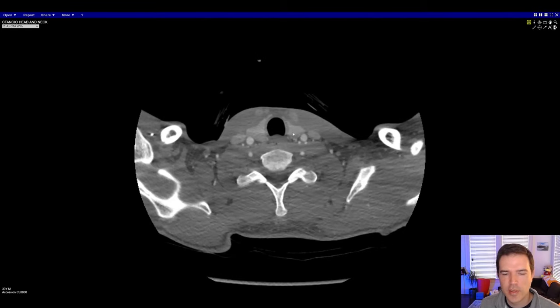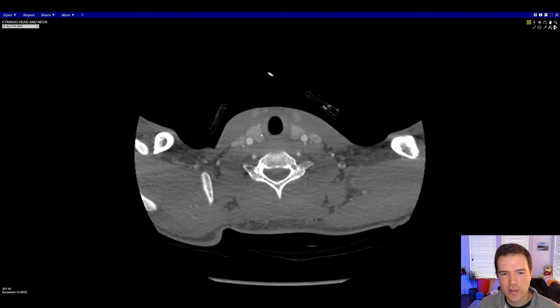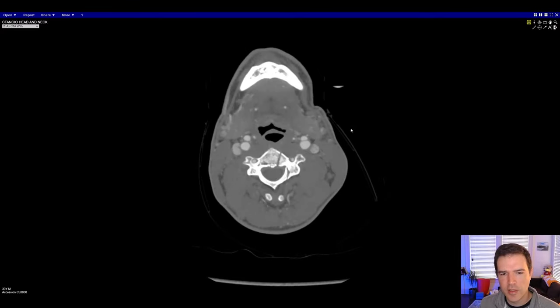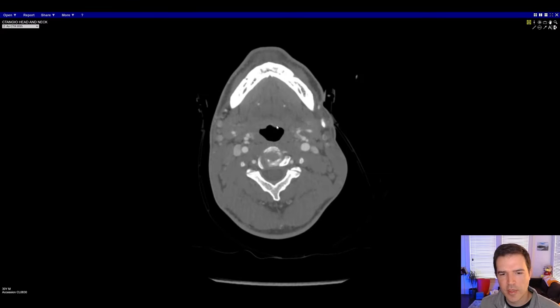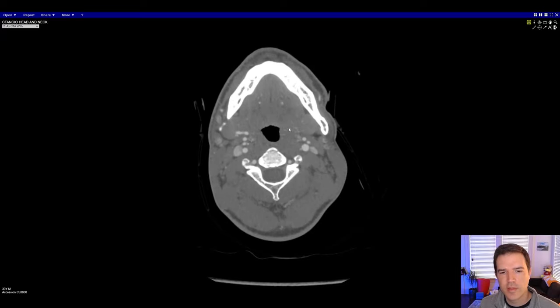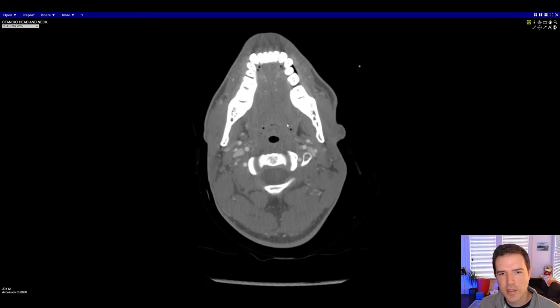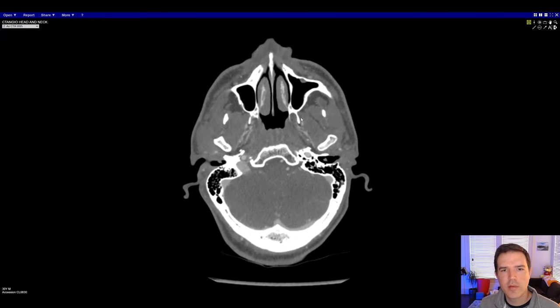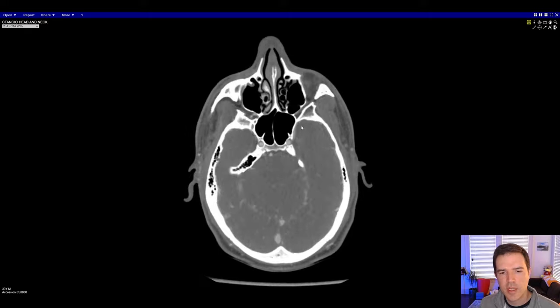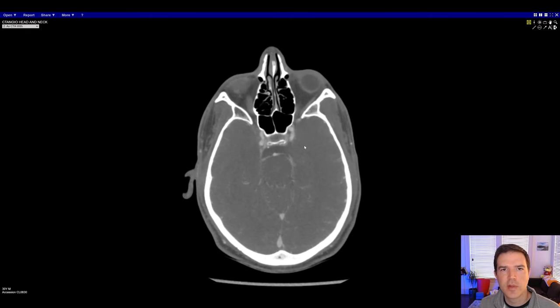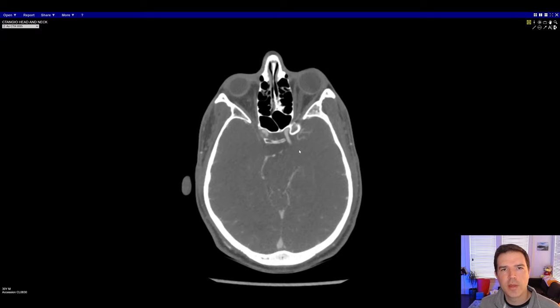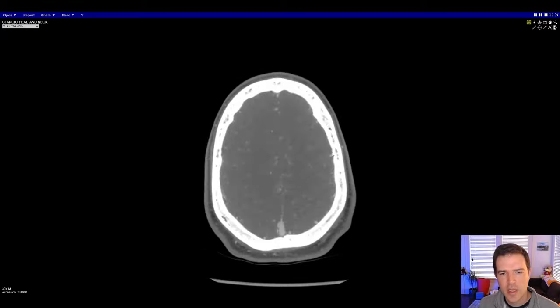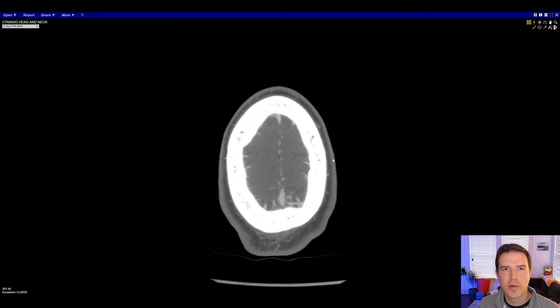We want to look at some key structures like the thyroid — make sure there's not a thyroid mass or any big thyroid nodules. We want to check the lymph node chains on either side to see if there's any abnormal lymph nodes. We should check the aerodigestive tract and make sure we're not looking at any masses of the oropharynx or tongue base. And as we come up, be looking for any abnormal enhancement, particularly in the brain, because a lot of these patients have neurologic symptoms and we don't want to miss a mass.